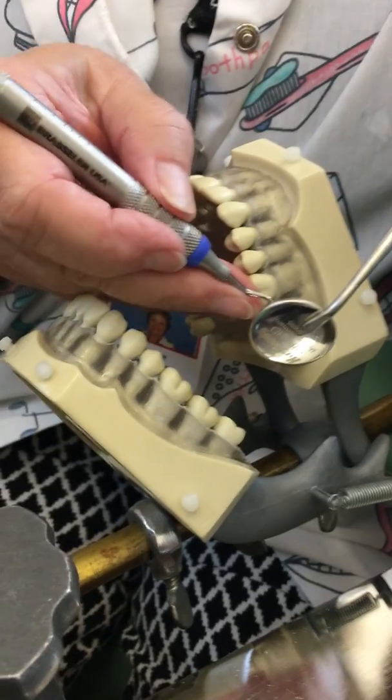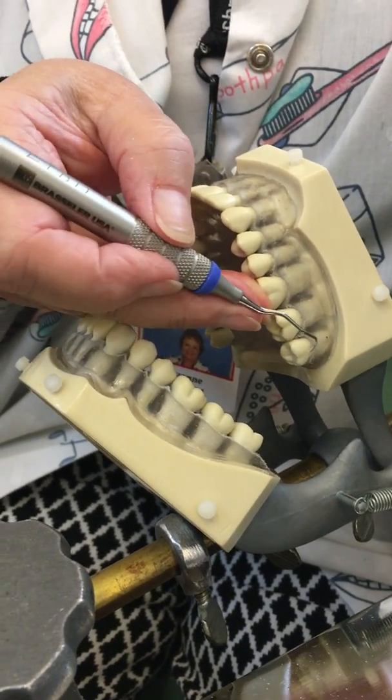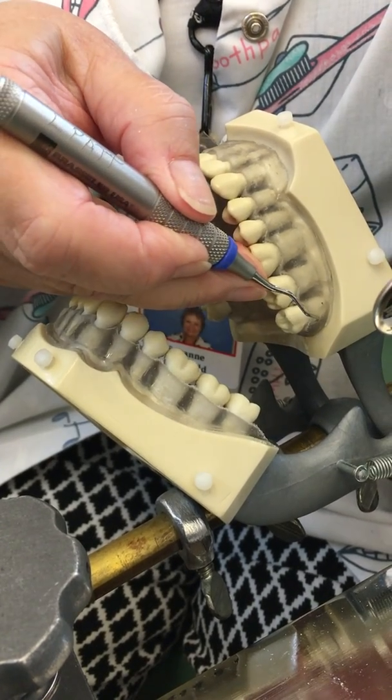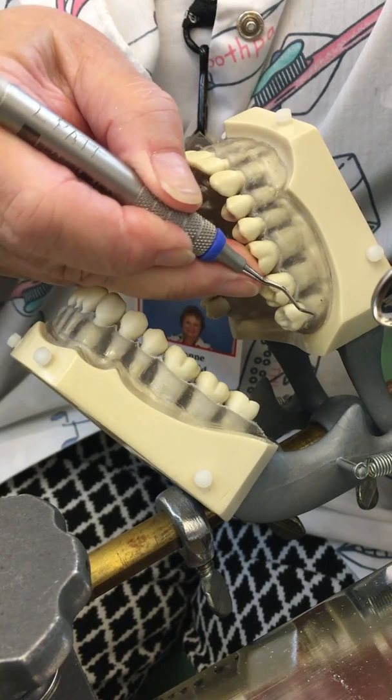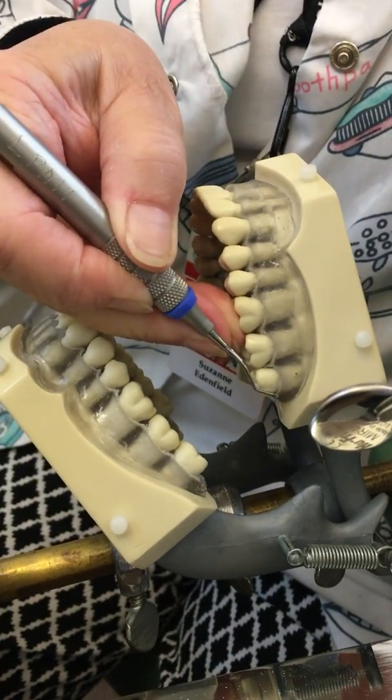I'm going to pull up on my fulcrum, extend my instrument, place my toe at the distal line angle, pulling closed and then open.